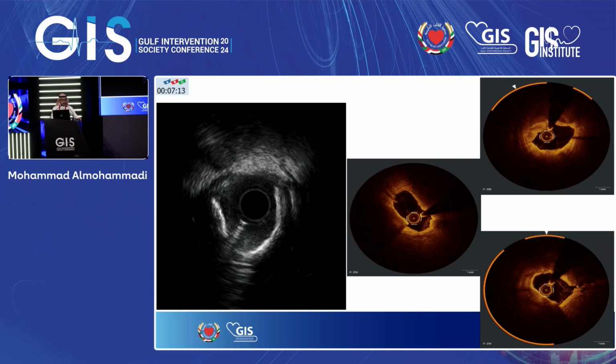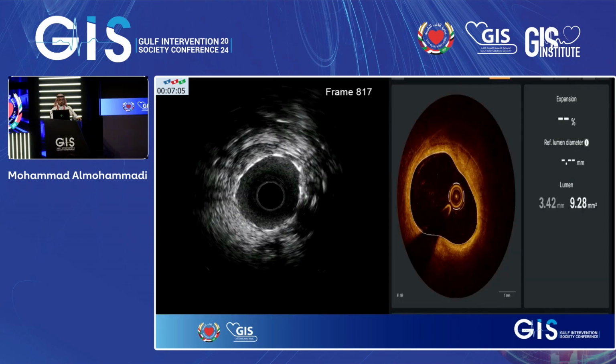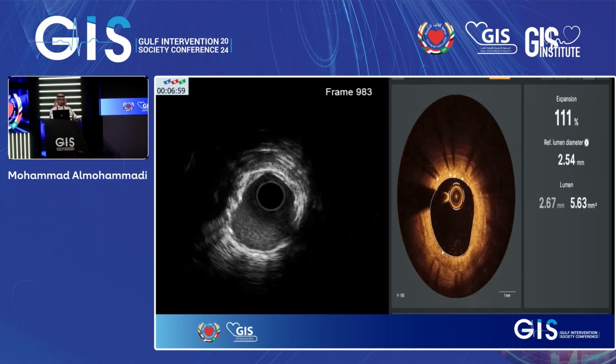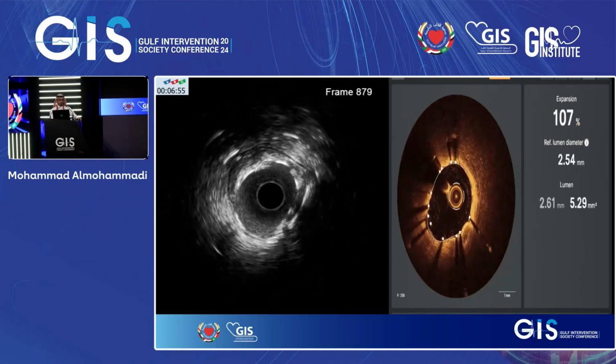Here are the still images. We can see the calcified nodule coming at 8 and 9 o'clock. So we used IVL in this one. And post-IVL and post-stenting showed a very good expansion of the stent, and we felt very comfortable. And since then, we've been favoring IVL for this option.